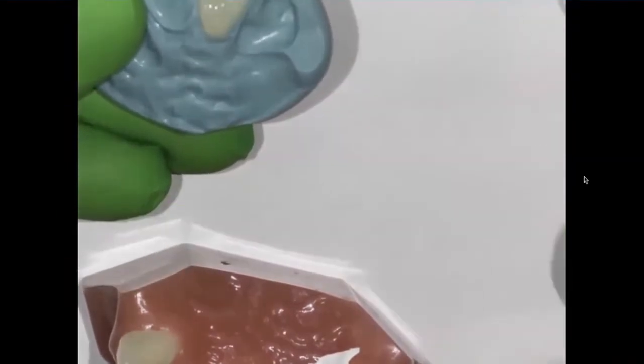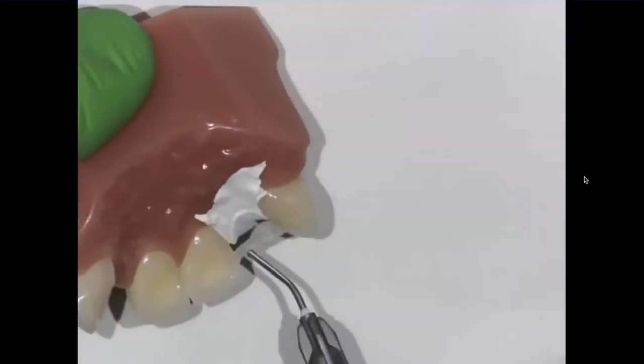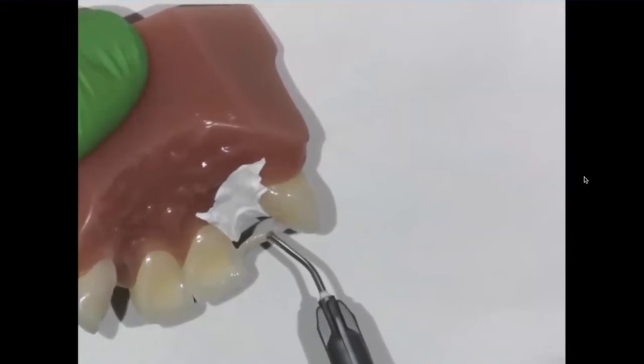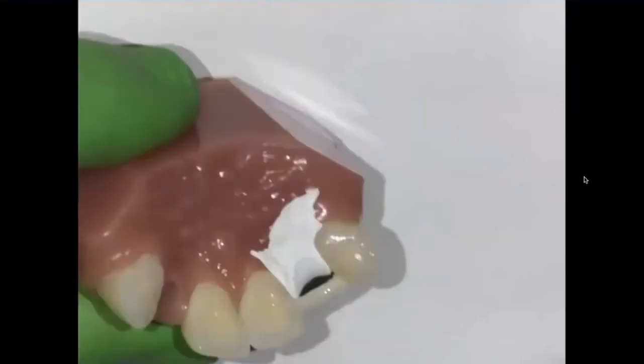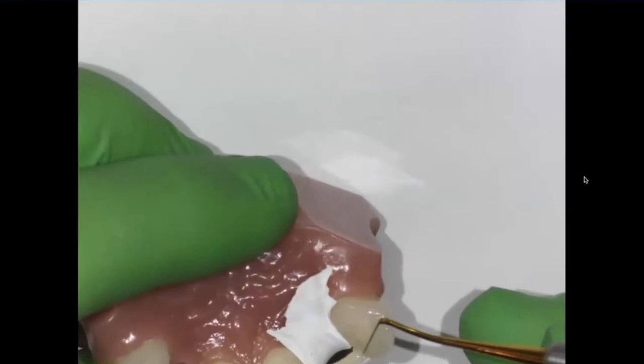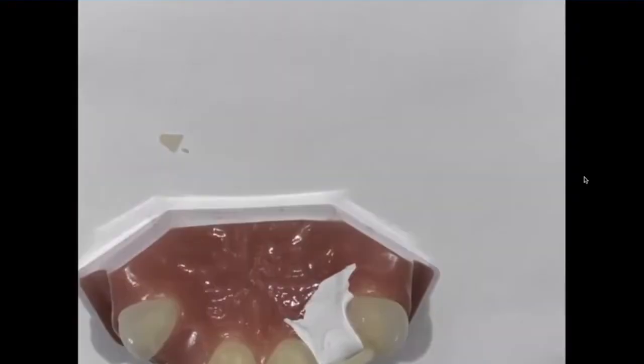Now I'm going to put this in my resin keeper to keep it from getting light polymerized. I'm going to come back with my flowable composite and layer it over onto the ribbon just like this. Now I want to make sure that I get the composite to seal up those inset areas that I use for placing in the ribbon bond.